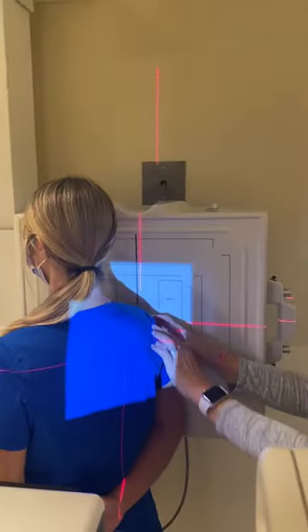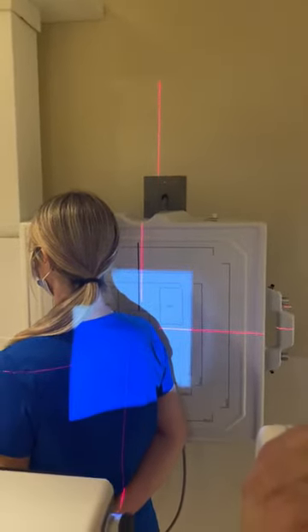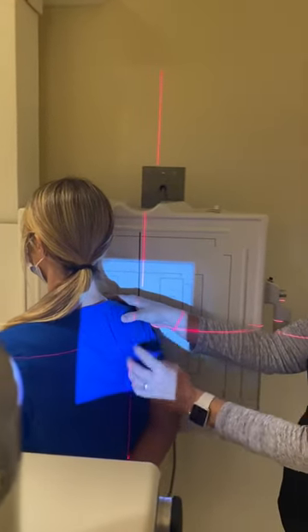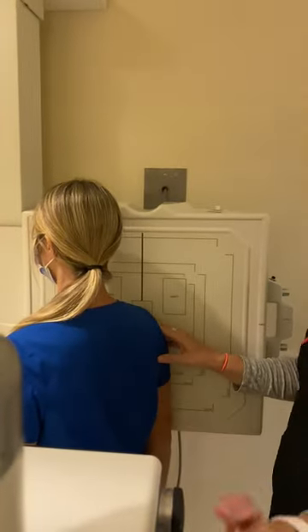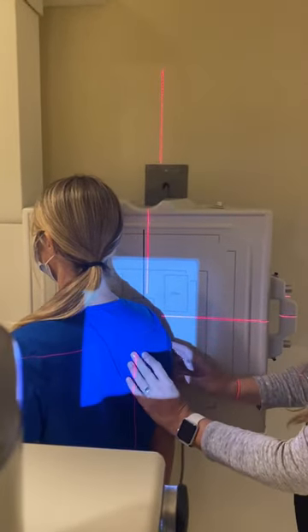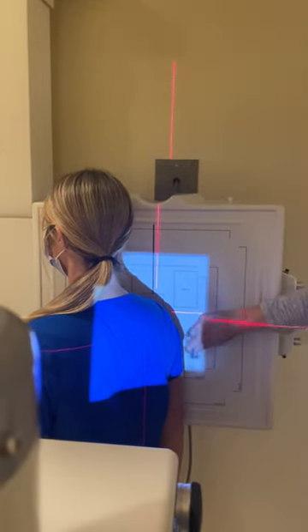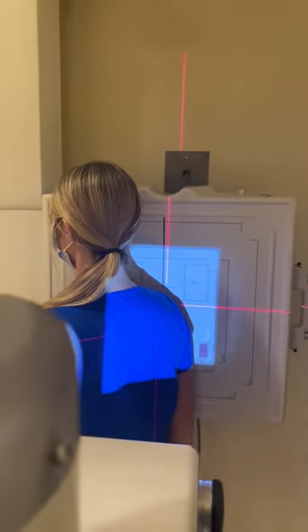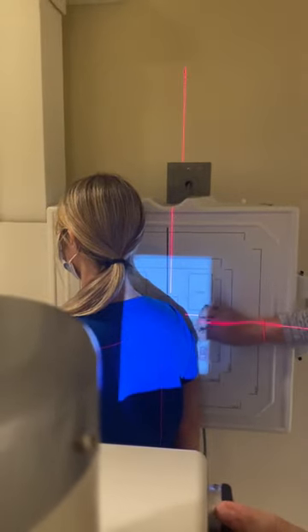This varies with your patient, but the point is to get the scapula perpendicular to the image receptor. If you place the patient's hand on their back, have them just put their hand on their backside. We want 12 inches length and 1 inch from the lateral shadow. Then we'll place a marker in the lower corner, place our shielding, and we're ready to take the image.